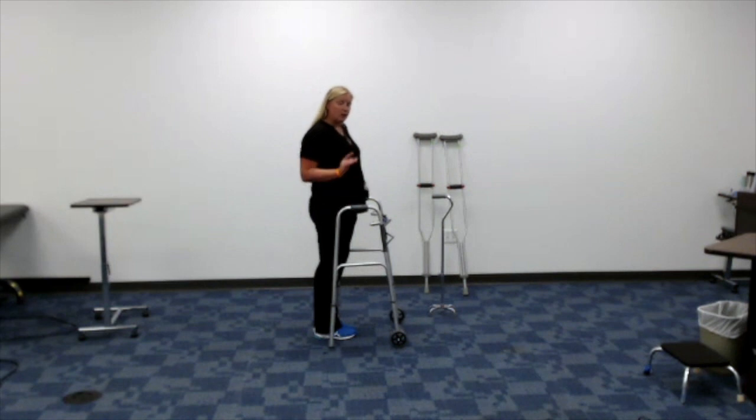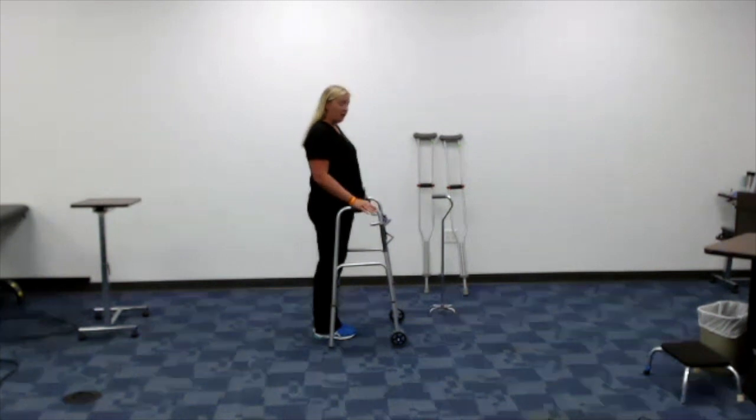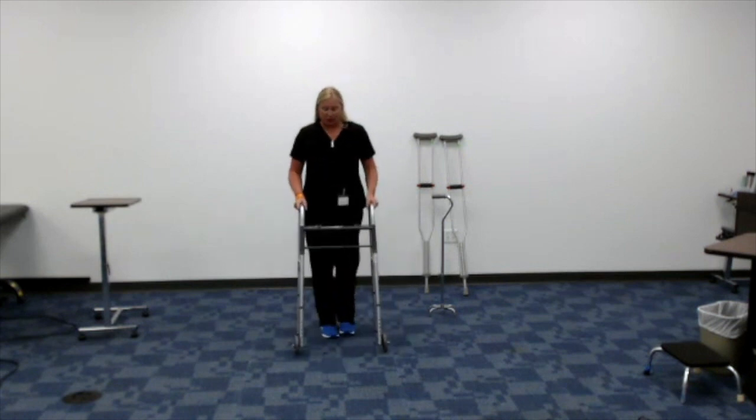The second is going to be my wrist crease. There's a little bony landmark that's called your ulnar styloid process. And so with my arm at my side with good posture, I want to see if it is going to align with the ulnar styloid process. And third is going to be really the most important. I want to make sure that my arm is comfortably resting with a slight bend in my elbow of about 20 to 25 degrees. That will be ideal for being able to advance the walker. And so as I'm looking at the 3 landmarks, this device is properly fit.